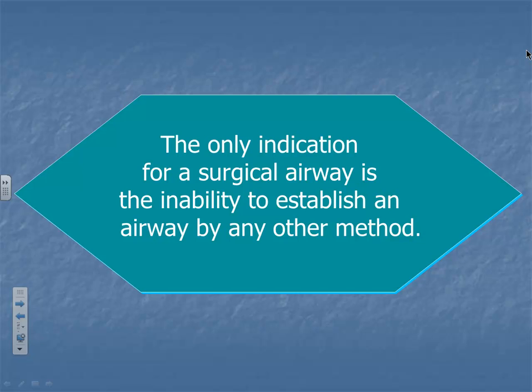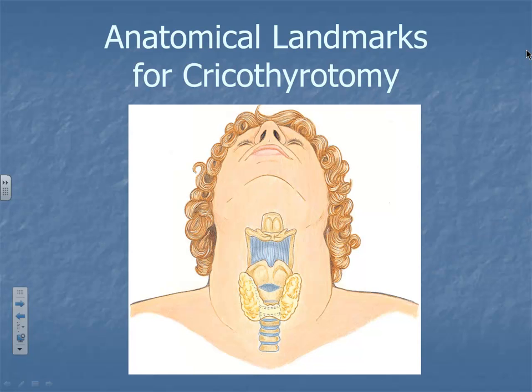The only indication for using to crike a patient, or taking your scalpel to them, is if you can't get an airway any other way. If you can tube them, if you can do a nasal, if you can do a digital, you want to do one of those before you go cutting in their throat. It is a fairly easy procedure, but there's always going to be risk involved, particularly depending on who's doing it.